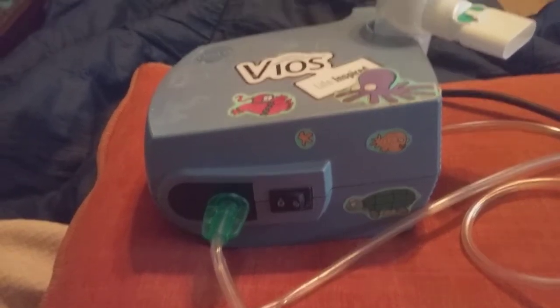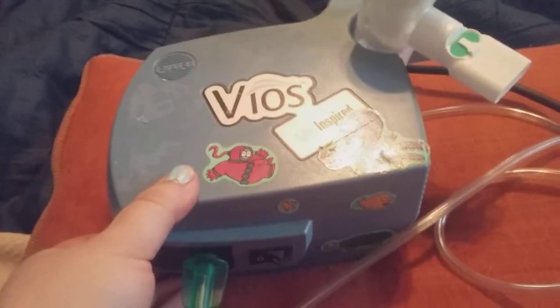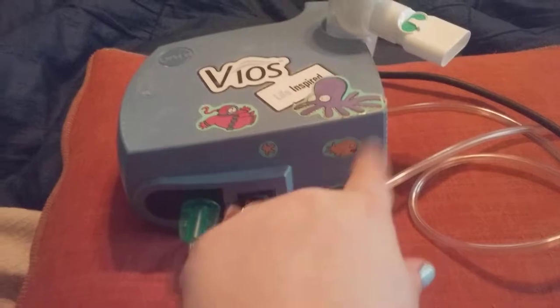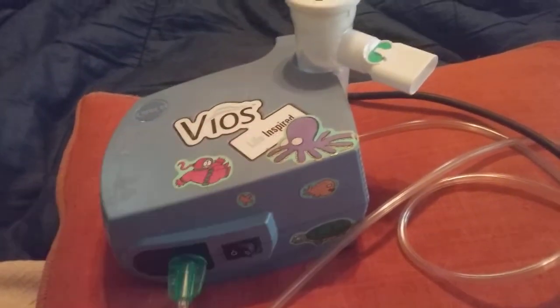Hi friends, family, and folks, and newcomers. This is Bridger Earl and this is a review for this nebulizer. It's the VIOS Life Inspired. And yes, I did put stickers on mine — just a way I can focus on something else when I'm taking my breathing treatments.